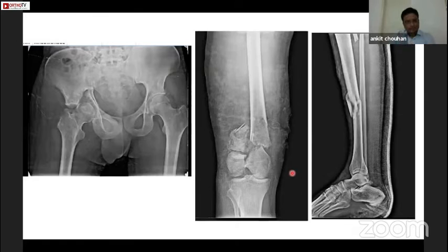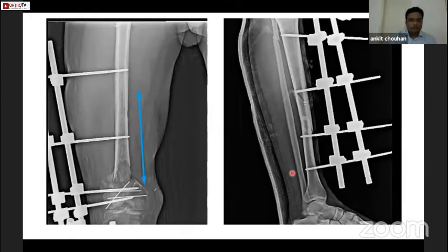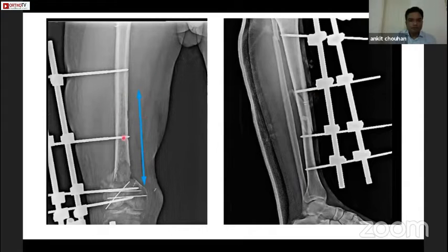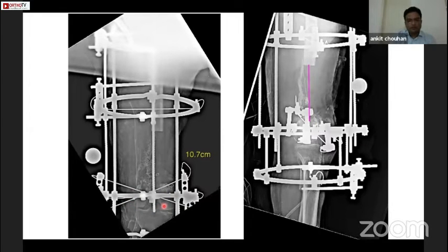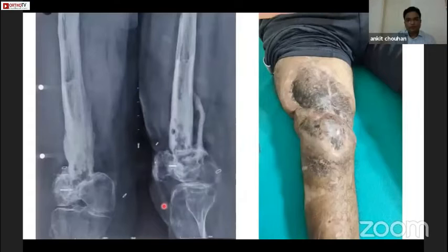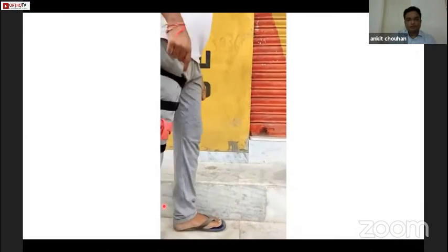The third case was a 30-year male polytrauma presenting six weeks down the line. The tibia fracture was healing but there was infection of a large piece of femur, and the patient had a neglected central fracture acetabulum with visible thigh swelling and cellulitis. Again a similar staged procedure was done. I would like to point out the use of crossed K-wires — in this small femur condyle fragment there were just three wires, but two were crossed in fashion. These wires hold well for around one year and this technique can be used when dealing with small fragments of bone. Three years down the line everything had healed similar to the previous cases.